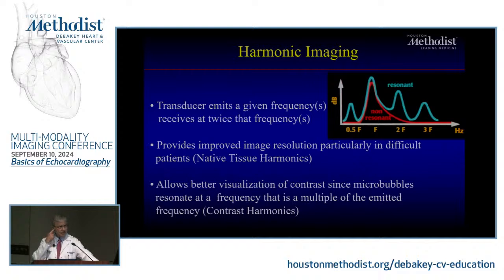So the thought is, if I emit at a certain fundamental frequency, but I listen at double the frequency, I will emphasize contrast as opposed to the other structures, thinking that the native myocardium doesn't resonate.